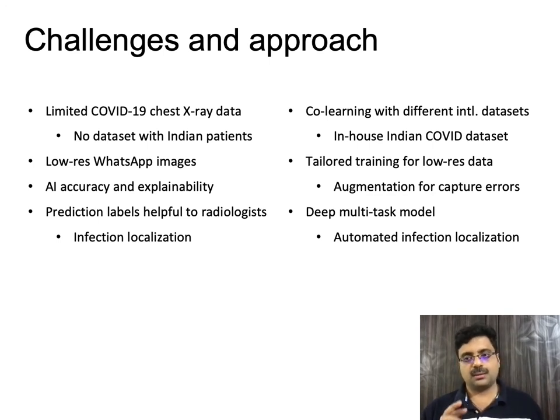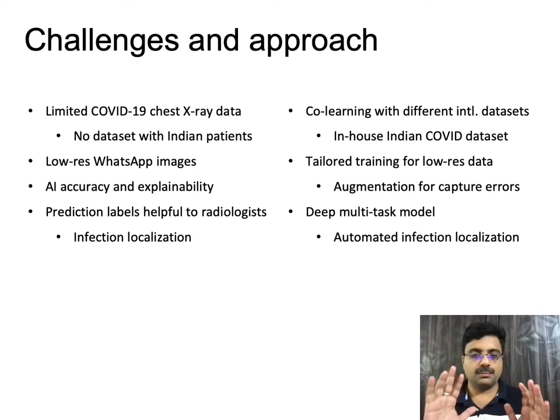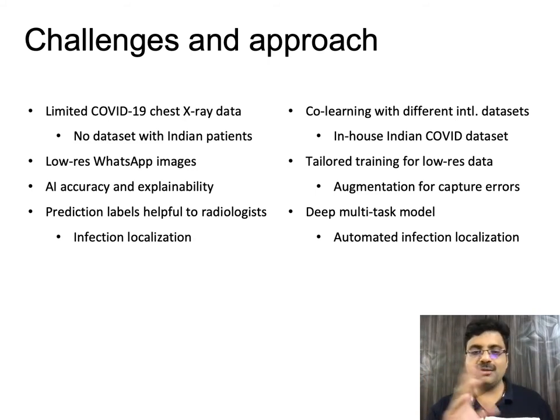In particular, image data is augmented if any photo capture error is detected. And what do we mean by photo capture error? So the image could be out of focus, there could be too many objects in the frame, the brightness may not be very uniform, it might not be very bright, the images could be blurred, you know, maybe the frame was not aligned properly, the projection was a little off. So any of these kinds of photo capture errors result in some sort of augmentation, which is relatively easy to do.